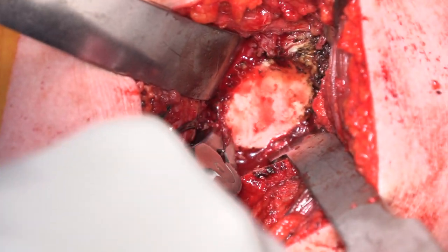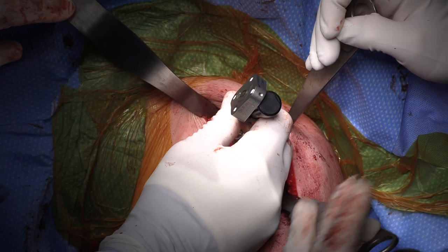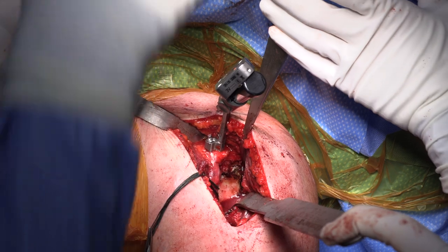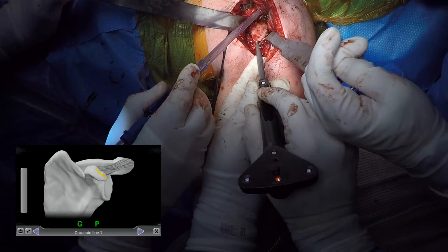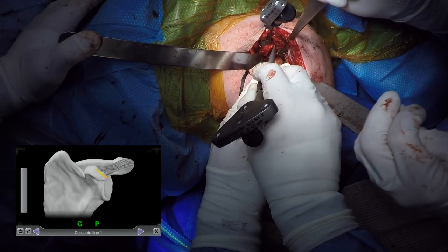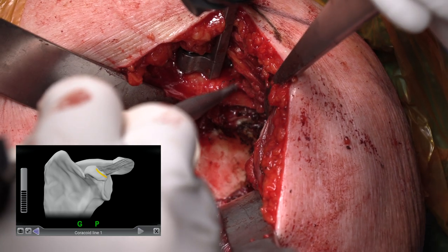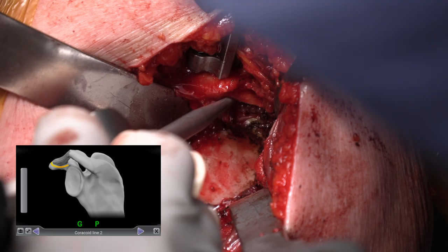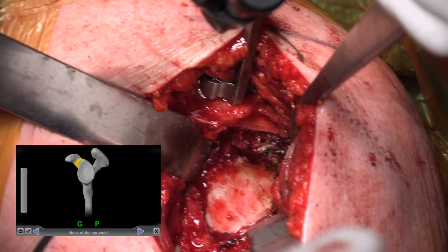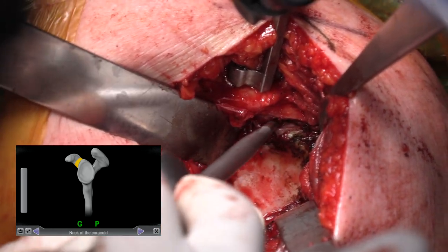With the glenoid exposed, the soft tissue at the base of the coracoid and the underside is removed to expose the bony surface. The anchor for the GPS tracker is then placed onto the superior aspect of the coracoid process so that there is a clear connection with the navigation device, and is secured in place by two screws. The GPS tracking device is then attached to the anchor. The data acquisition device is used in combination with the GPS computer, and sequential acquisition of the data points is performed beginning with the coracoid and progressing to all data points.